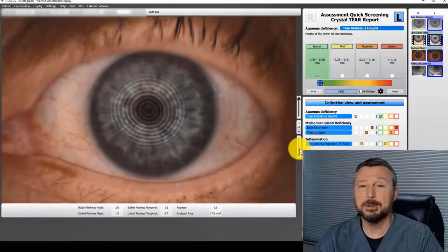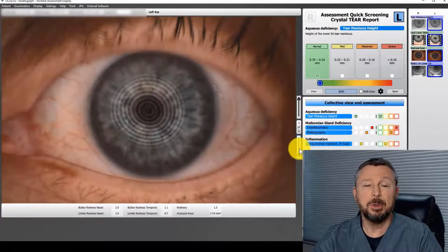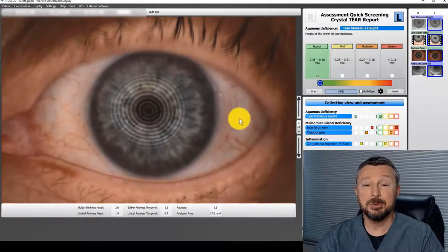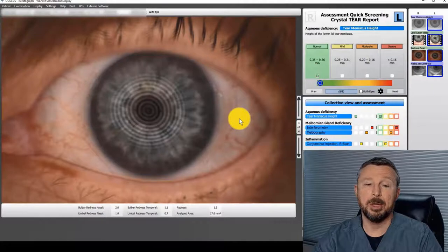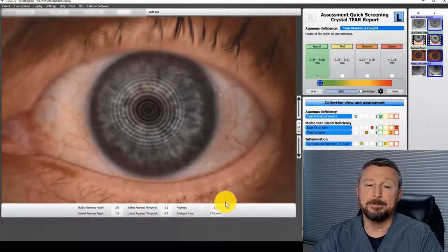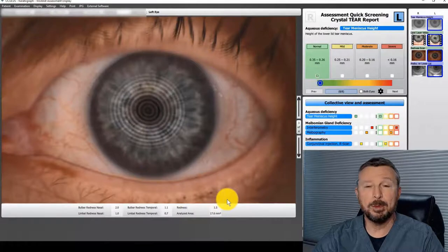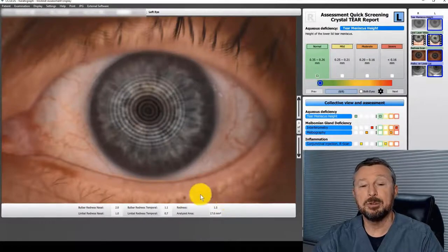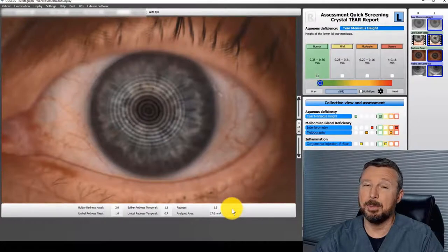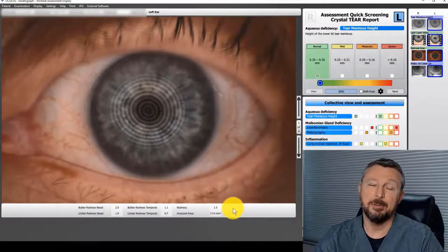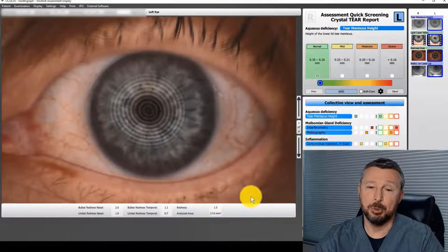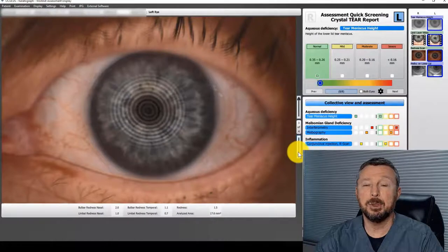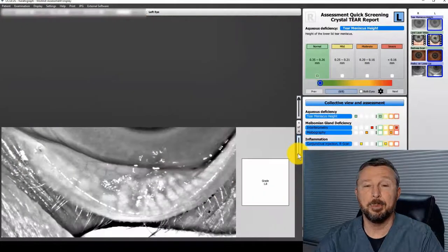Here we can see you really don't have any oil visible. Let's look at the redness of your eye. The computer looks at the white part of your eye and measures how much red it sees, giving us a numeric value. Your redness score is 1.5. Normal amounts of redness would be anything from 0 to 0.5. So at 1.5, you're three times redder than we want you to be. Redness is a measure of inflammation, so you do have some inflammation here.